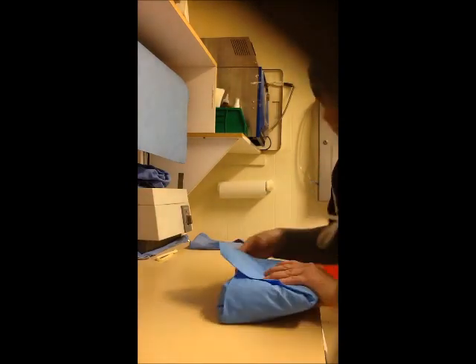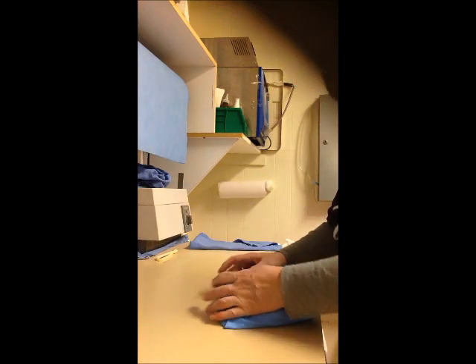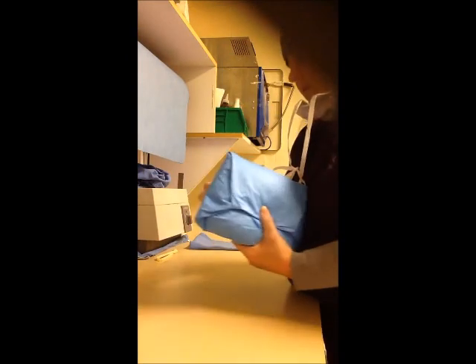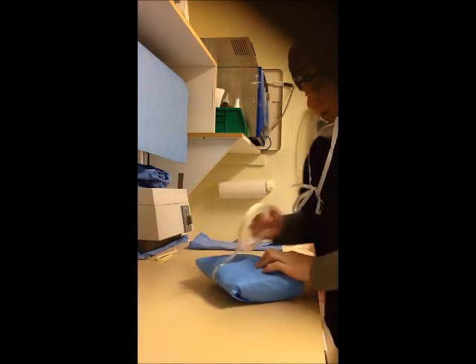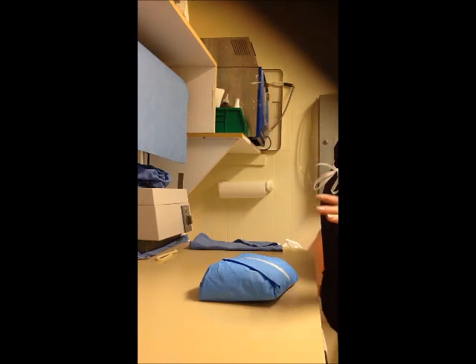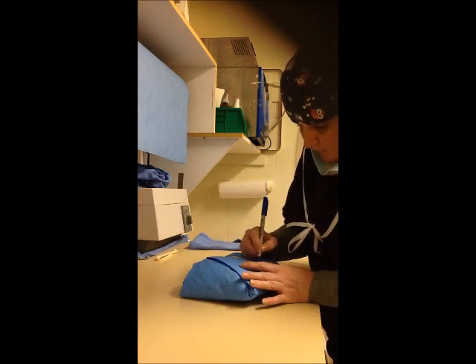And I flip this over, pushing at the same time to make it nice and snug. Tuck this little thing in here with the flap sticking out, and then I'm going to take my tape, and the tape is also indicator tape, so pull that all the way around, and that just lets me know that once it goes into the autoclave, the entire package has reached the temperature.